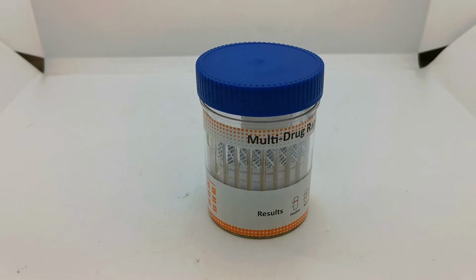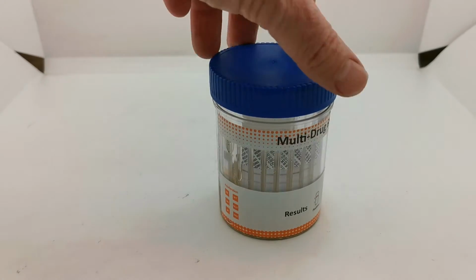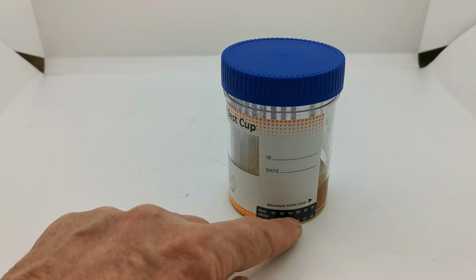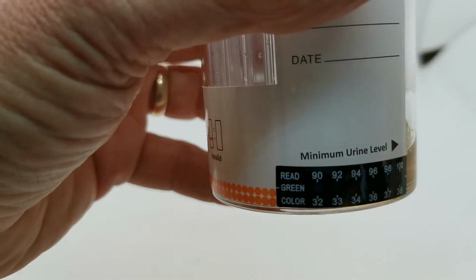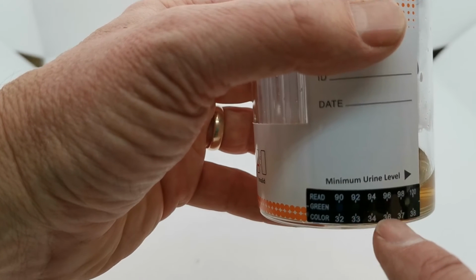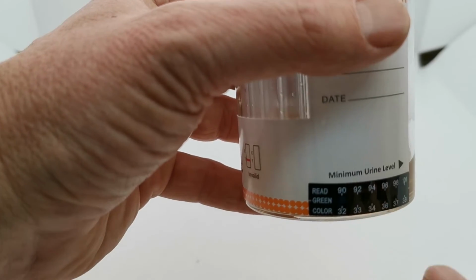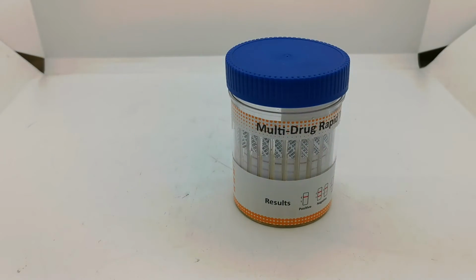But what we are going to advise is to read it at the correct manufacturer specified time, and embedded here on the left hand aspect is your 3-pad adulteration check. Now we've got a temperature strip on this pack as well down here at the base, and you're looking for one of the boxes in between the Fahrenheit on the top and centigrade scale on the bottom to just slowly glow very subtly. I don't think this is going to pick up particularly well on camera, but I've got a box showing here at 92 and 94 and 90, but no boxes above it. It's a very subtle change on these temperature strips. It doesn't clearly give you a bright colour change on the actual temperature, but that passes the temperature check to indicate that the sample is at roughly body temperature.